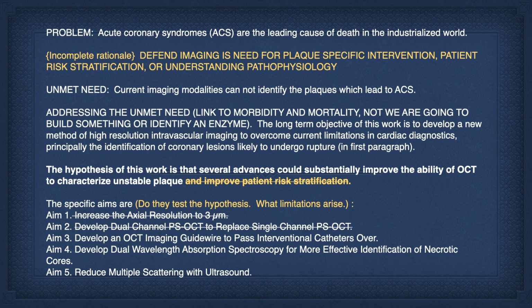Is there a reason to go from single channel to dual channel PS-OCT? I am unaware of it. Any strong argument for it? It's covered in the PS-OCT lecture, and I think that we get all the information we need from single channel. And in both Aim 1 and Aim 2, achieving these is going to give us increased limitations or problems with the technology, or make them more error prone.